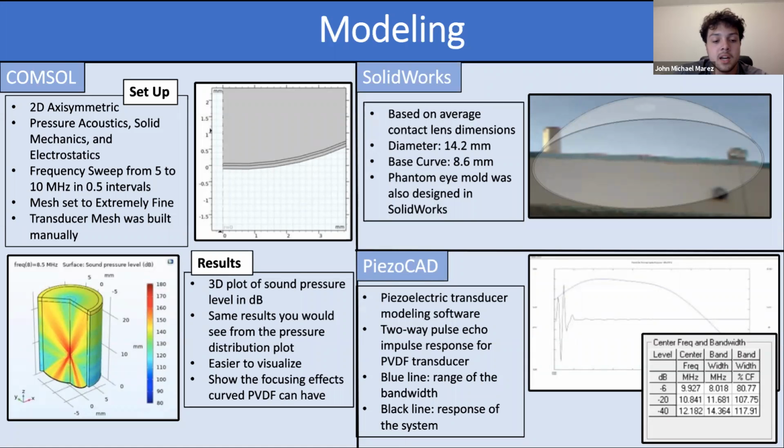However, the software did not allow for us to test a curved design. Overall, PiezoCAD allowed for us to see the impulse response from a two-way pulse echo. We also tested lithium niobate as a transducer since that was our alternative.